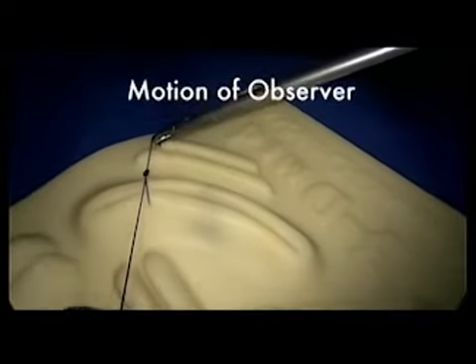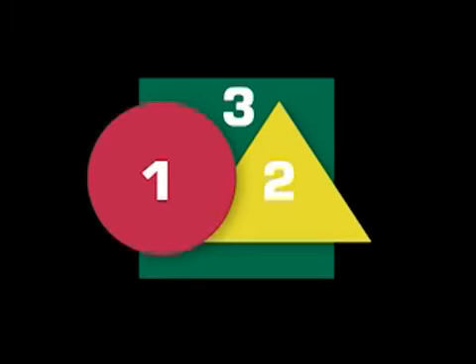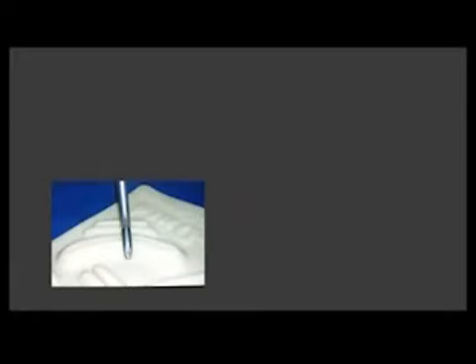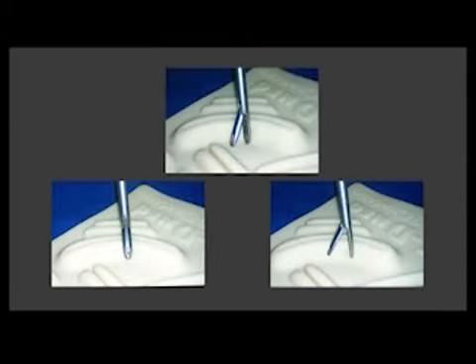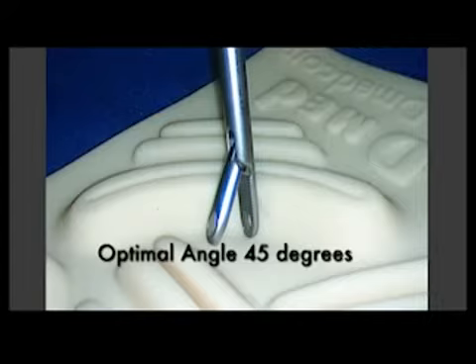Motion parallax occurs when the observer changes their perspective in relation to a stationary object. Occlusion results when one object blocks another object, which allows the surgeons to rank objects in their order of depth. Occlusion cues can aid or impede a surgeon's ability to efficiently grasp objects. The rotation of the instrument tip alters the visual angle created between the laparoscope and the jaw of the instrument. The optimal visual angle occurs when the tip of the instrument is rotated at a 45-degree angle relative to the laparoscope, because this allows the most information about depth to be inferred.